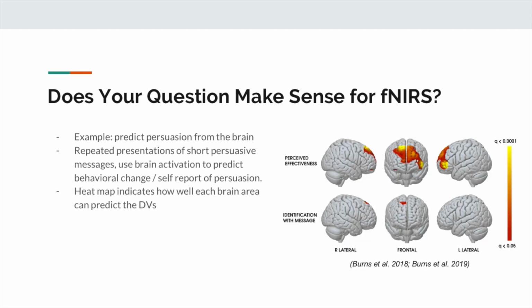So, some examples of that in fNIRS work: anytime you go to an fNIRS training camp, they always have you do the finger tapping task, where you do 10 seconds of this, 10 seconds off, and then you can do a really fast, really easy general linear model of the motor cortex. And you can see nice pretty activation for wiggling your fingers over not.